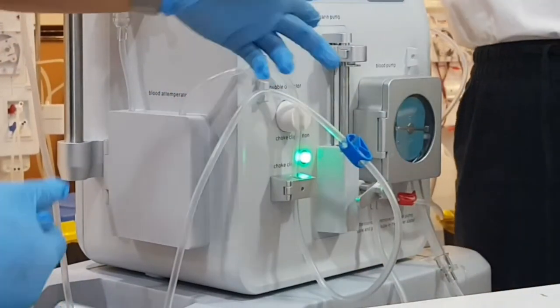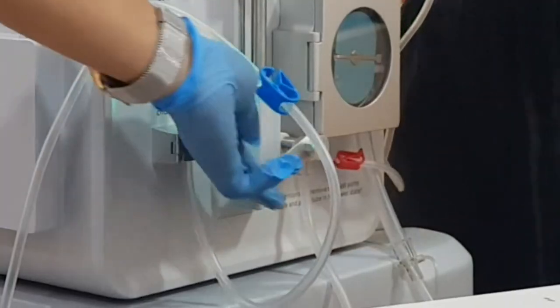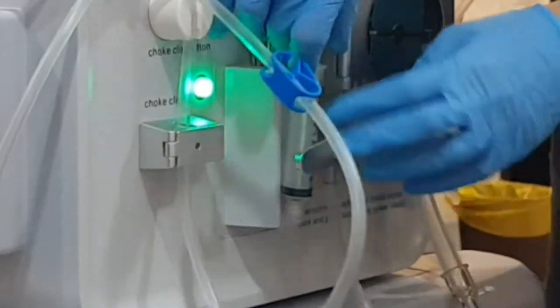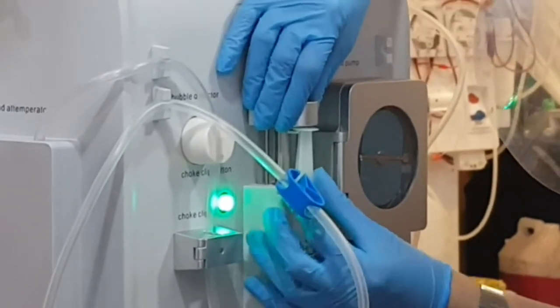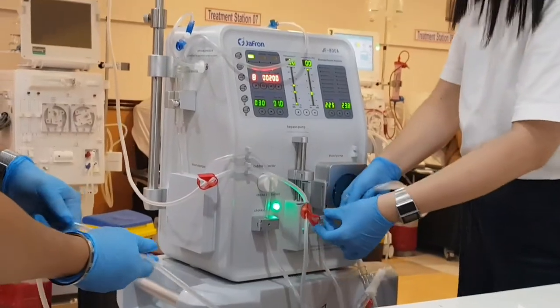For the extra lines, the machine also has clips where you can clip them. Next, heparin: the syringe requires a 20 cc barrel size, the same size as Fresenius, but I'm using a 10 cc syringe for demo purposes only. The heparin pump has a door, so open that and place the syringe inside. For the plunger, fit the flat end inside the heparin pump plunger. Next, connect the infusion line.